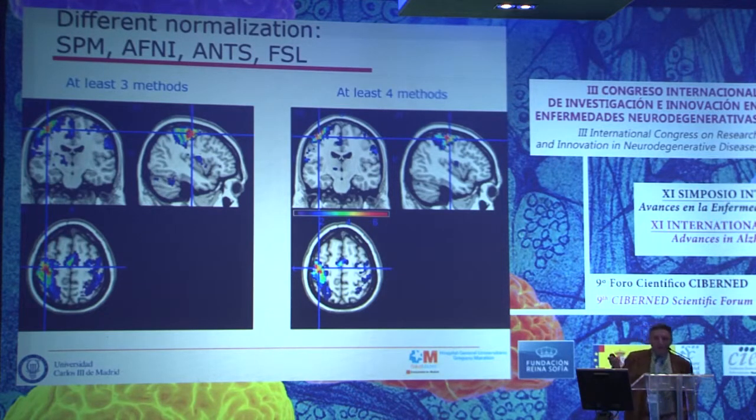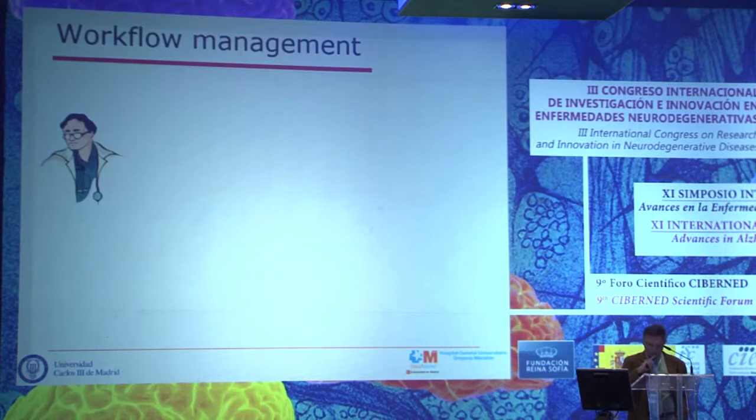So these are, so to speak, the more credible or more reliable results, because I obtain the same result no matter which processing method I use, while all of the remaining results depend more on the method. So this is the type of thing we can do, but of course, as you can see, that means you have to process the data many times, and this is quite expensive in terms of computer power.